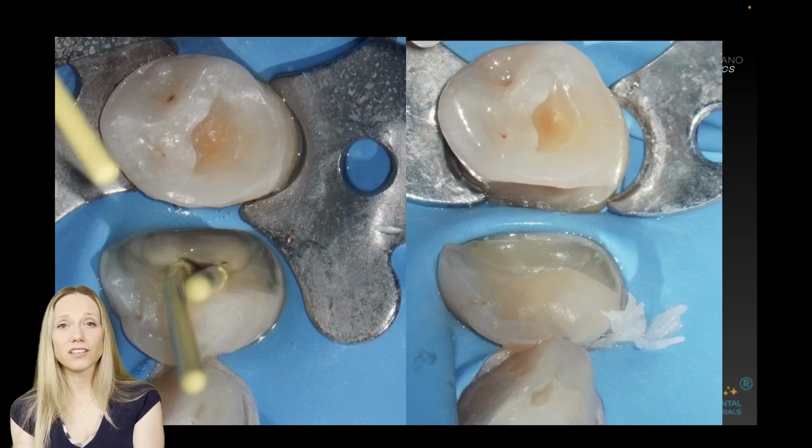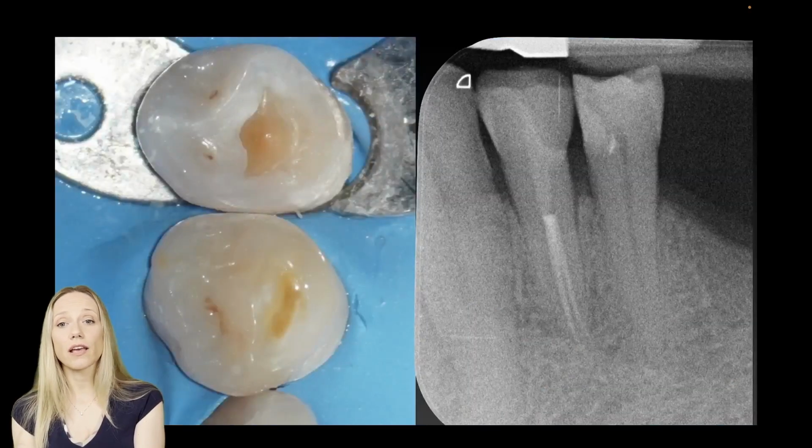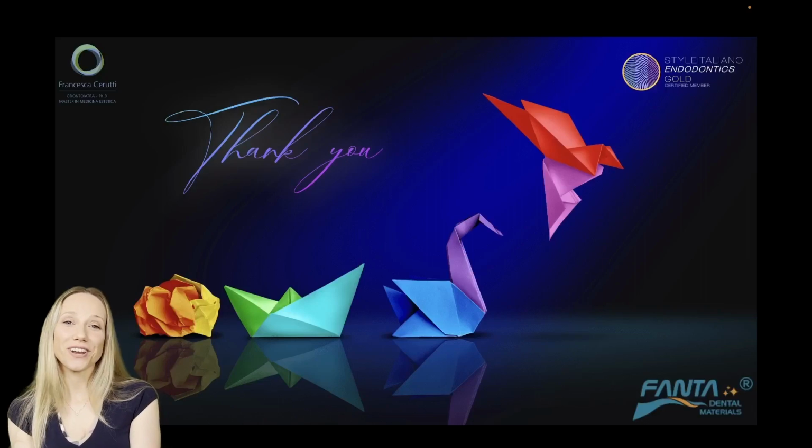I use the easiest technique. Then I do a build-up because I'm doing an indirect restoration on the first premolar, and then I do a direct pulp capping on the second premolar, direct restoration, and I lute my onlay. And that's the result. So I hope you enjoyed this short lecture, and I thank you very much for listening.